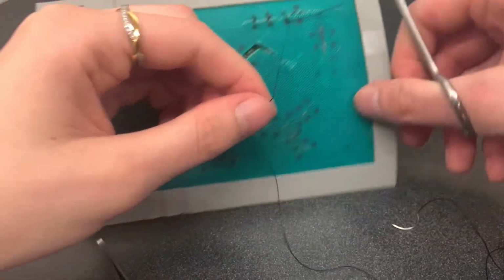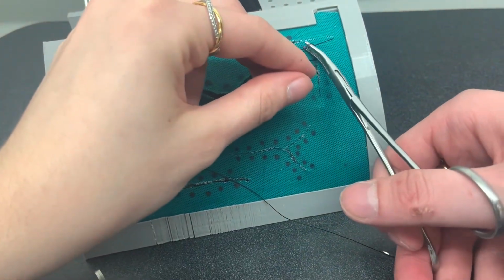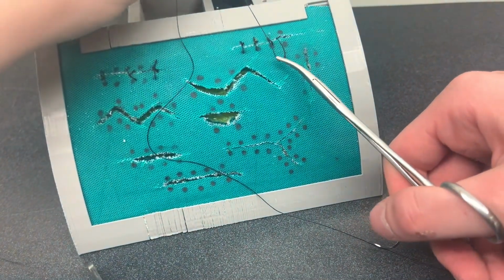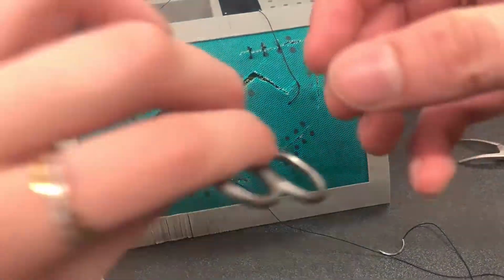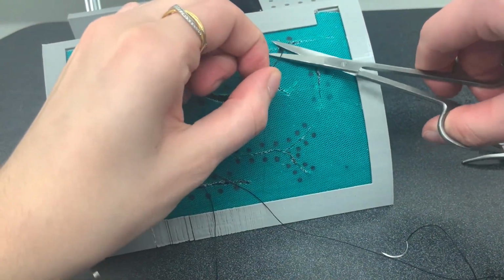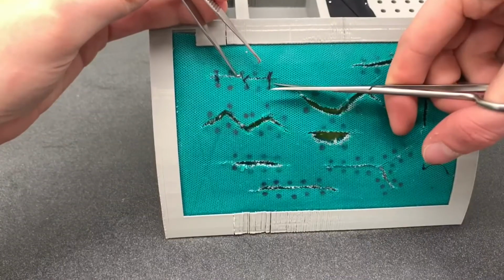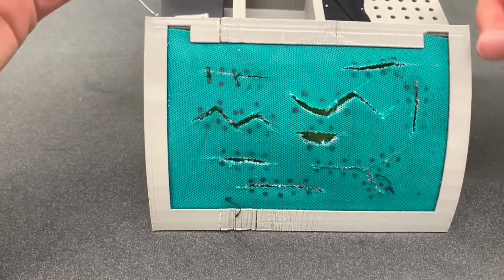Along these lines, dots have been placed which guide the user in the placement of their sutures. The user must accurately suture the nonlinear lines to close up the laceration. The task can be used multiple times up until the synthetic skin rips, in which case it can easily be replaced with a new piece. In order to reset this task, the user can simply cut the sutures.